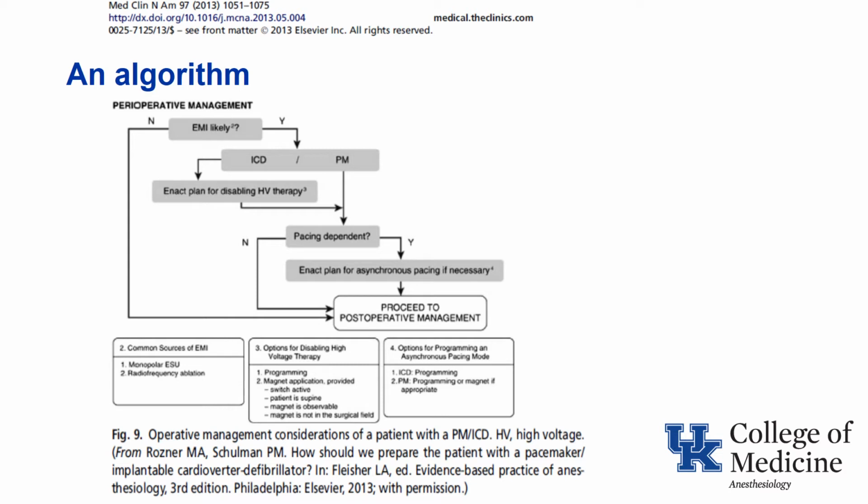Following this algorithm, if EMI is unlikely, then you proceed directly to postoperative management. This slide does have some practical advice regarding the magnet, and that is that the switch on the CIED should be active, and that the patient should be supine, and that the magnet should be observable, and that the magnet should not be in the surgical field.